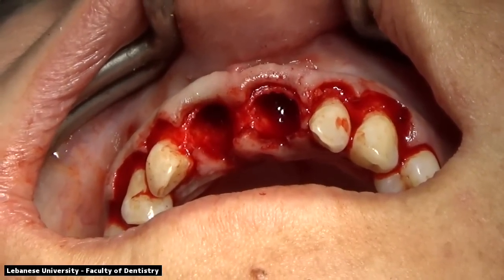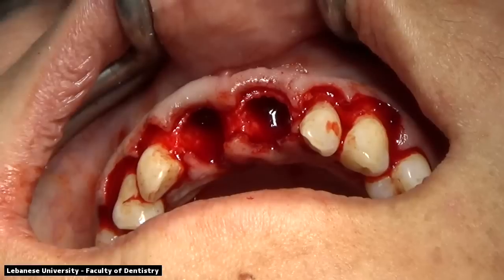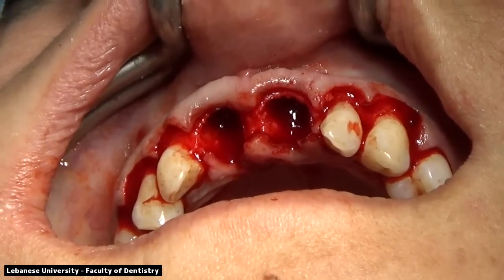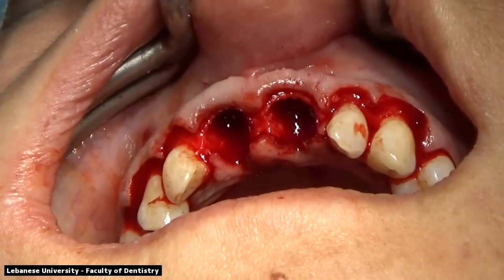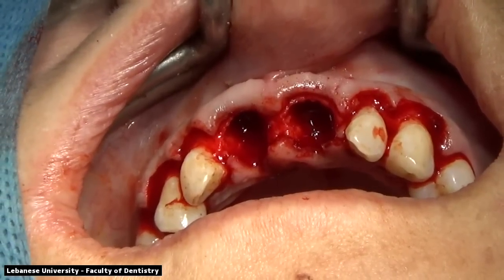What we need to do when we're doing an extraction and immediate implantation is that we need to go in a palatal direction. We do not go in exactly the same direction as where the root is, so that we can engage more of the palatal bone on the site, and it will give us initial stability. So we're going to go slightly with the tip of the burr to the palatal aspect so that we can engage more bone.